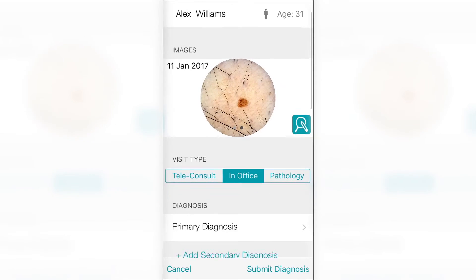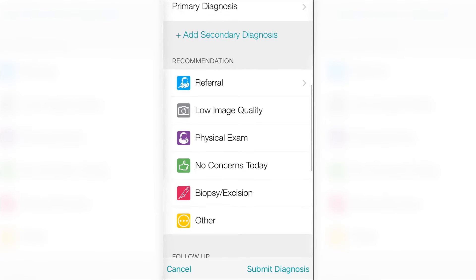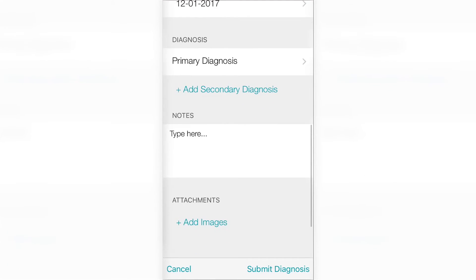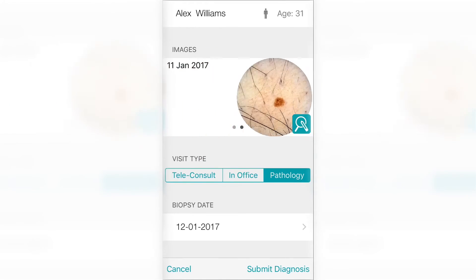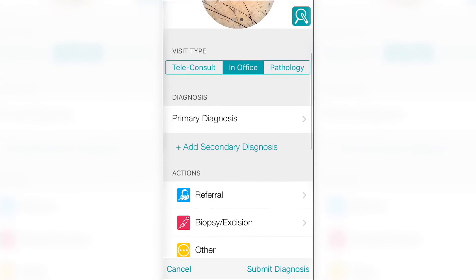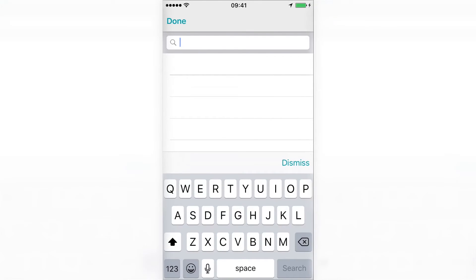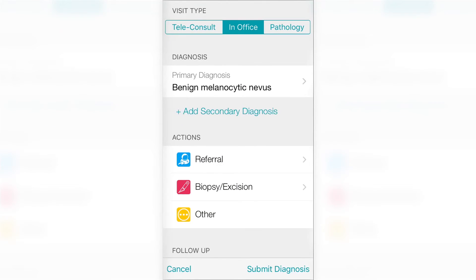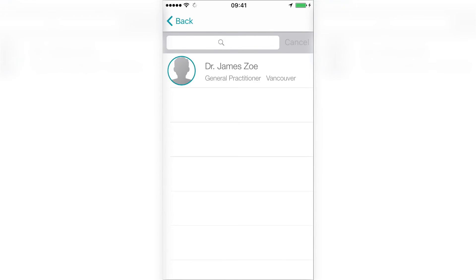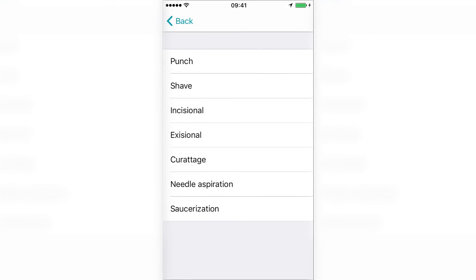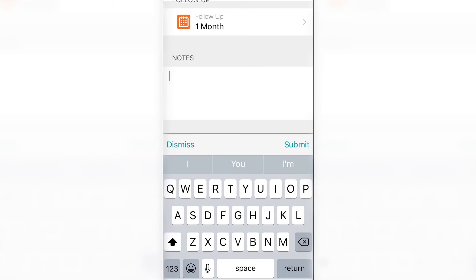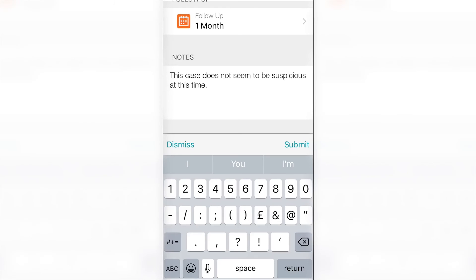You can choose your visit type as a teleconsult with the option to add recommendations, or create a pathology report, or conduct an office consultation. You can specify the diagnosis by using the drop-down menu or by typing one in, and you have the option to add your differential diagnosis as well. As your recommendation, choose one of the following actions: refer the patient to a colleague in your network, recommend a biopsy or excision, or select a specific date to follow up. To complete the consultation, add notes to your report — you can write your own or select from the recommendations. Finally, submit your diagnosis.